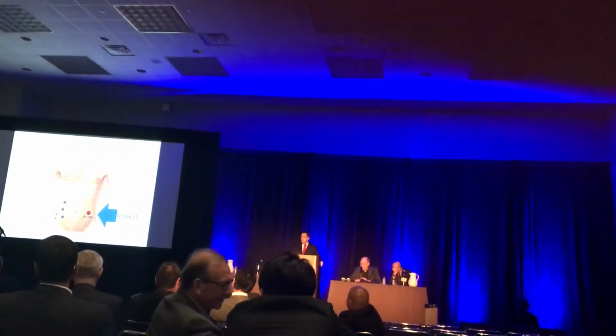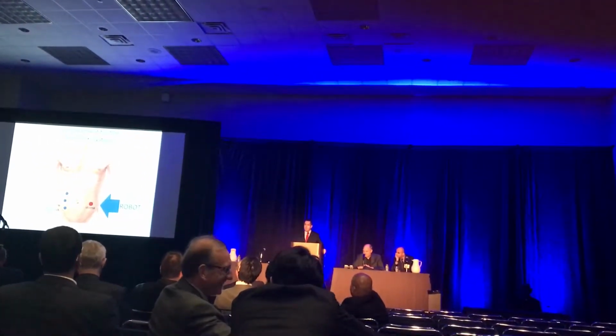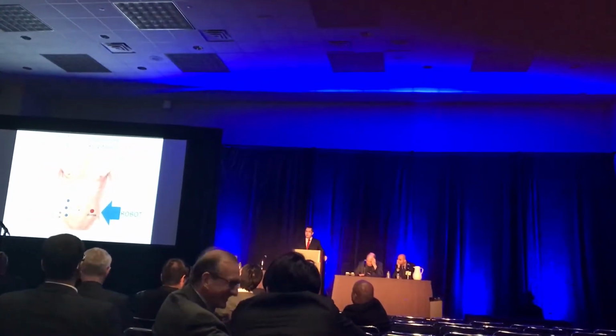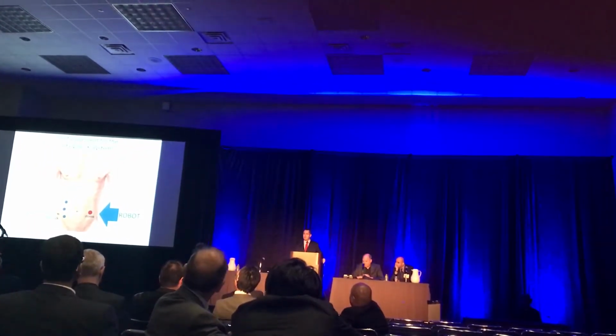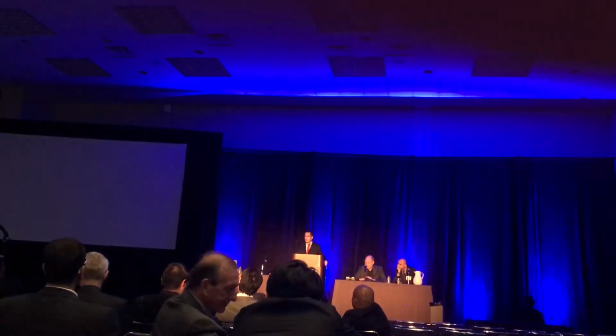This picture shows how we dock the robot from the side of the stoma, and then we use two 8mm ports and a 12 with a piggyback of 8. We use the 12 to introduce the mesh material and the sutures.